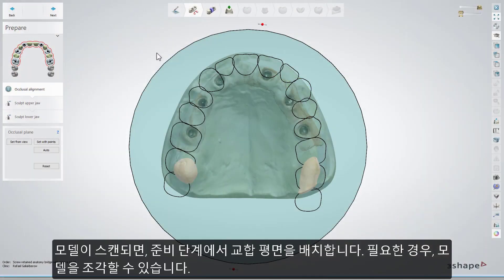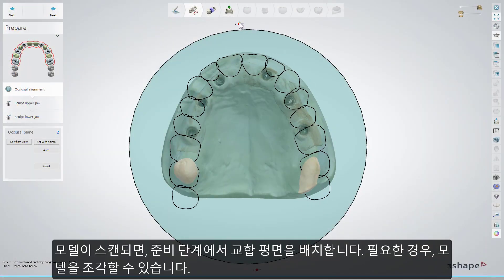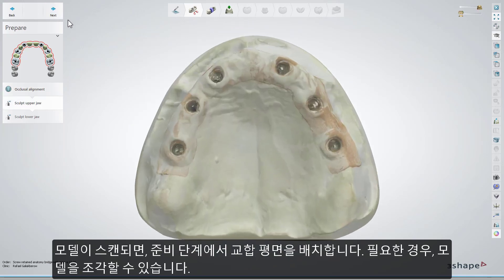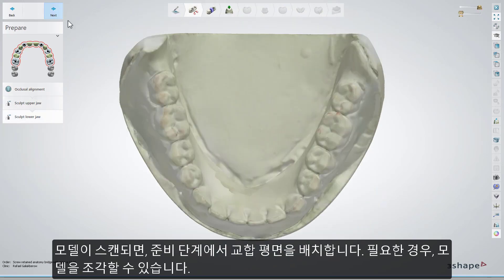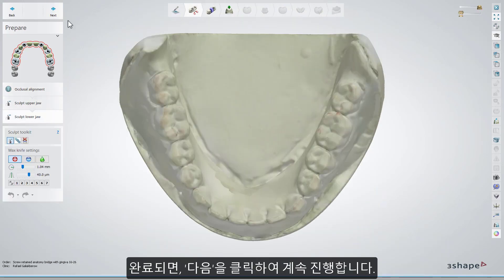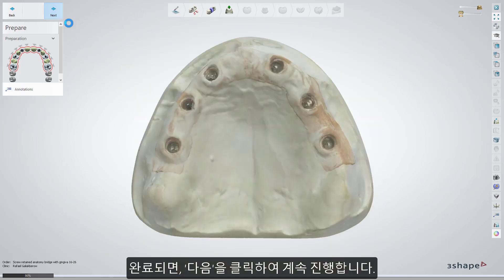Once your model has been scanned, you'll start from placing the occlusal plane while being in the Prepare step. You can also sculpt models if necessary. When done, click Next to move further.